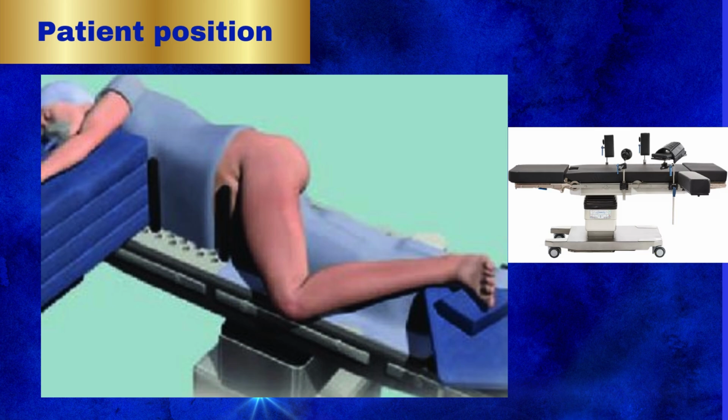The patient will be placed in lateral decubitus. In lateral decubitus, the patient is placed with the hip to operate on the top. Adequate padding is then required with double support on the front for the anterior superior iliac spine and back for the sacrum to keep the patient's position and sustain the body pelvis.